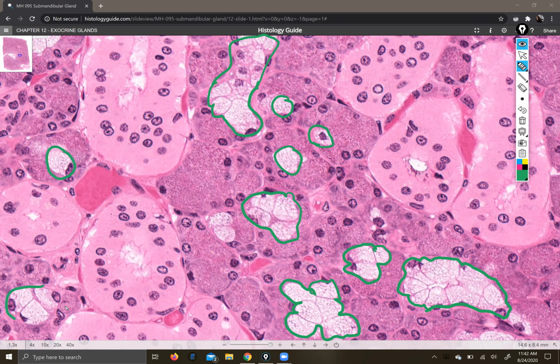Usually they're in clumps. So the reason I picked submandibular gland, and to be perfectly straightforward with you, the reason I'm going to mostly pick submandibular gland for quiz questions, is that of the three salivary glands, you've got your parotid, your submandibular, and your sublingual. The submandibular is about half and half mucus and serous. The other two, not so. So this particular slide just gives you a good chance of seeing a nice mixture of different kinds of acini, including the chance to see serous demilunes.